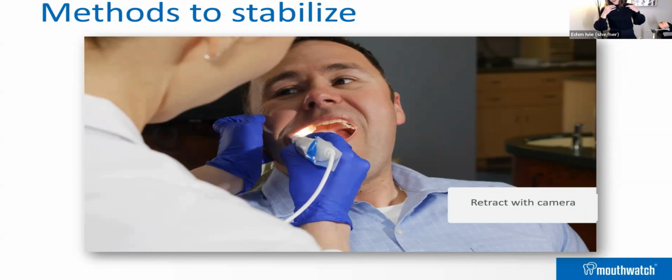Now, as dental providers, we use indirect vision all day long. We're staring in a mirror. We worked really hard in school to be able to get good at indirect vision. Cameras are direct vision. So if you get in the mouth and you are having a really hard time getting the tooth you are trying to get in the image, tell your brain, this is direct vision, not indirect vision. It's a little mental trick, but it made a huge difference for me.